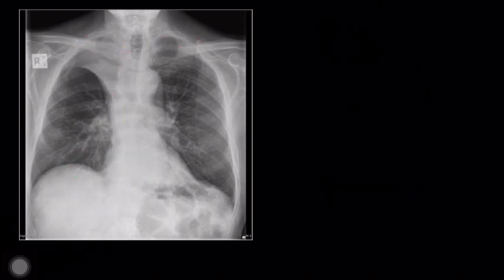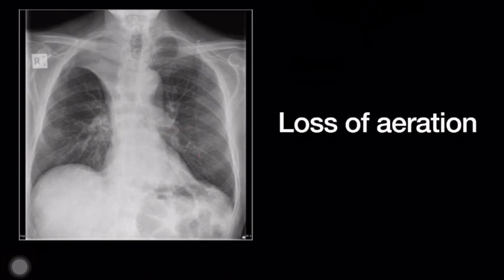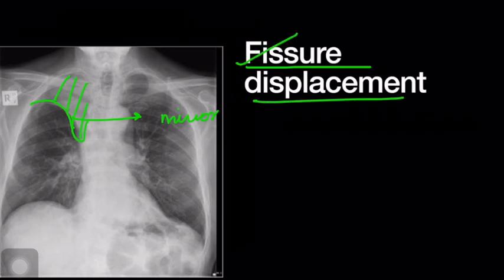At this juncture, we shall see whether this actually fits into collapse. Now let's revise the direct and indirect signs. The white opacity refers to loss of aeration — this is one of the direct signs of collapse, and that is present. Now let's see about this sharp margin which delineates the opacity — it is nothing but the minor fissure, satisfying another direct sign of collapse: displacement of the fissure.